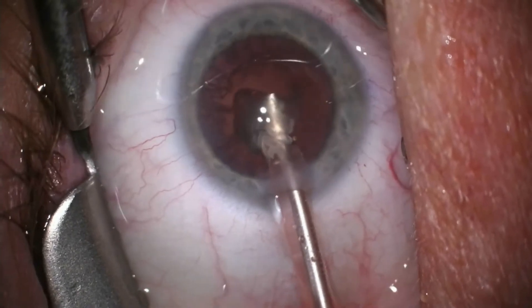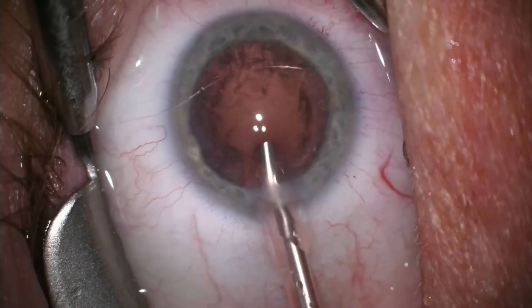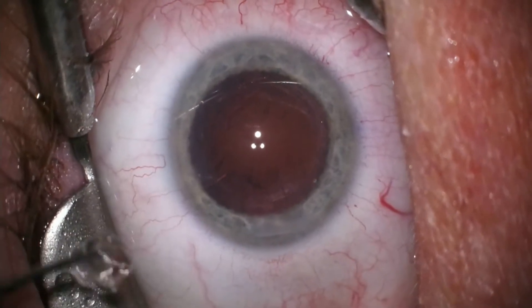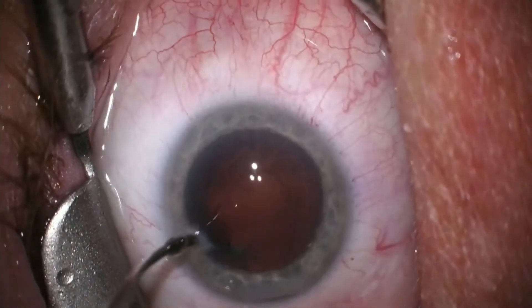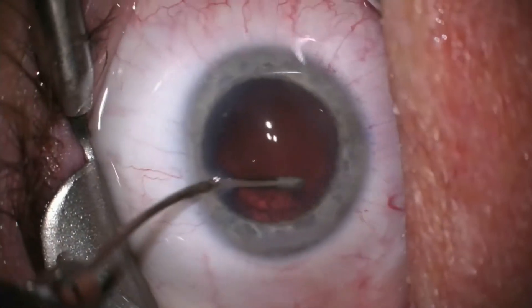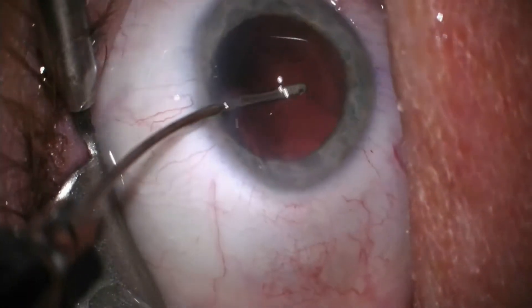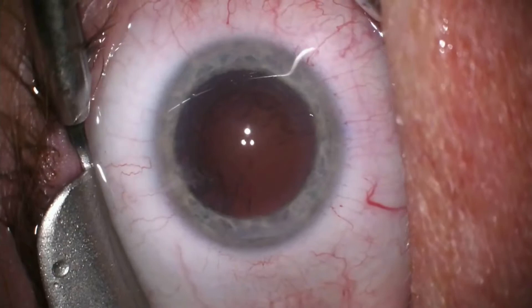Here we can see the last piece of nucleus coming out. The softer, more peripheral cataract material called the cortex is then carefully stripped from the capsule and aspirated from the eye — first the cortex under the incision, and then the remainder is aspirated, thus leaving the back capsule intact.